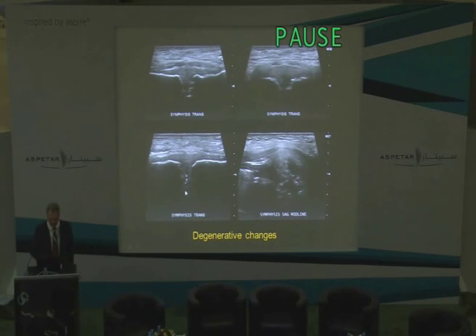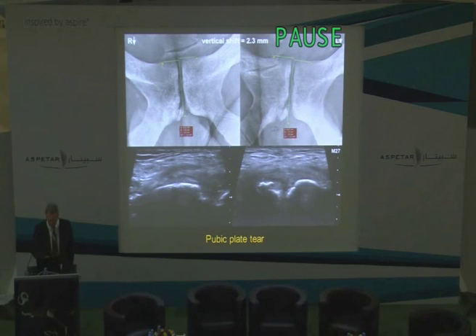And in this other example of only a 27-year-old, there's a wide primary cleft with gas bubbles, these bright echoes sitting in a fluid zone. Now, a very common finding in the athlete with chronic groin pain is a tear. This is the sonographic equivalent of the secondary cleft that you've been seeing already today on MRI. But we see these routinely on ultrasound as well.